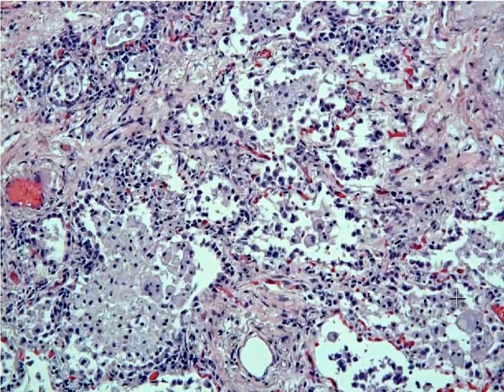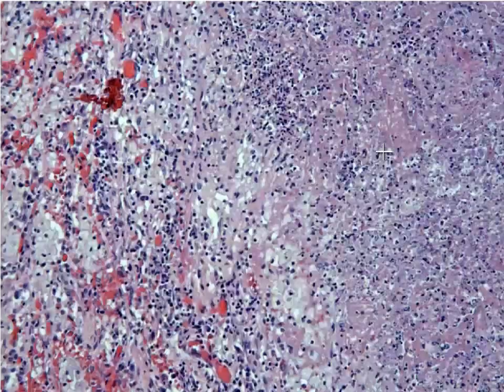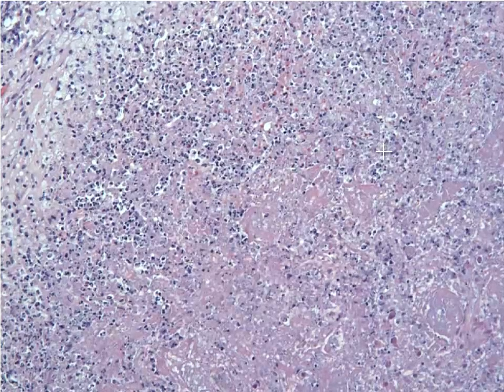And you can see that you have some vessels, and these are the alveolar spaces. And within the alveolar spaces, you'll notice these big foamy cells. These are all macrophages. And so macrophages are part of the chronic inflammatory response that come in to clean up the damage, as we spoke earlier.